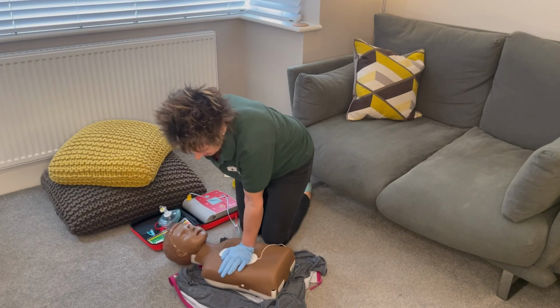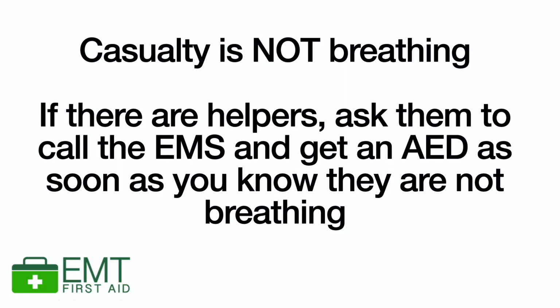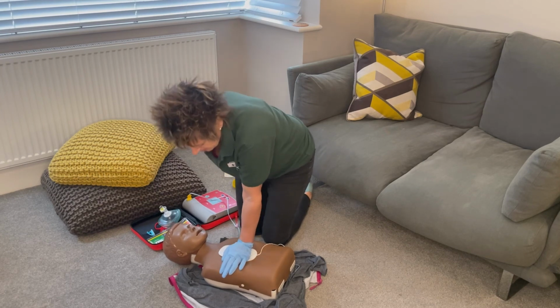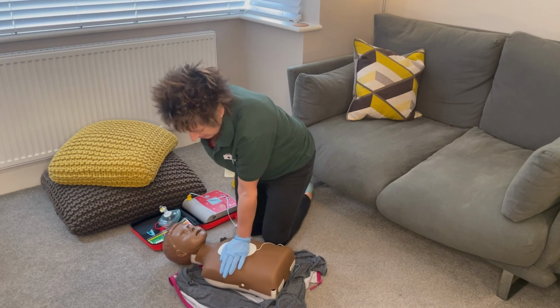Now, if I had a helper there with me, we do not delay in calling the emergency medical services. If there's a helper there, we know this child's not breathing, we send them to go and get an ambulance straight away and come back with that AED.